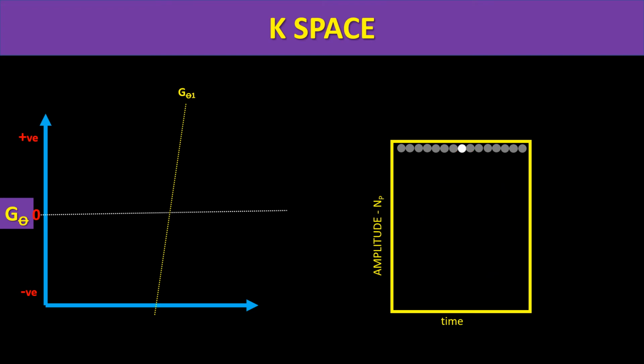But also understand that there is one more interesting thing. This is shown as maximum amplitude in the center, minimum in the periphery. One more thing that we have to understand is, see in this image, if you compare two points, okay, this image is better. If I compare this point with respect to this point, there is maximum difference in the phase, so there is maximum change. So the periphery is showing maximum change.